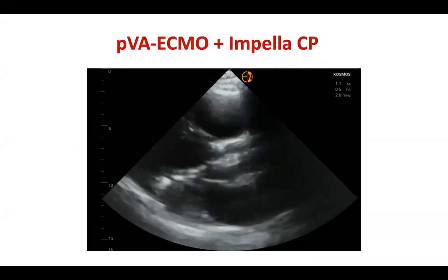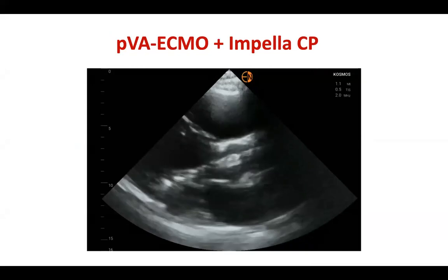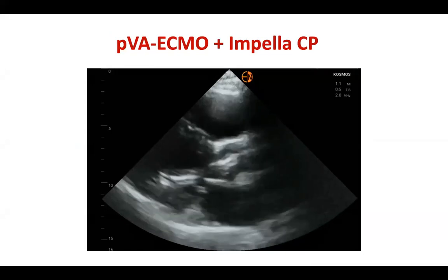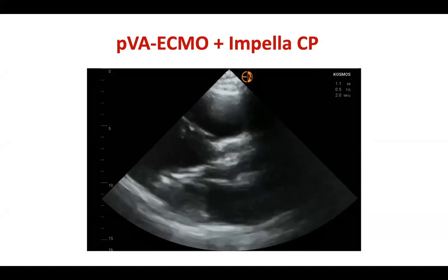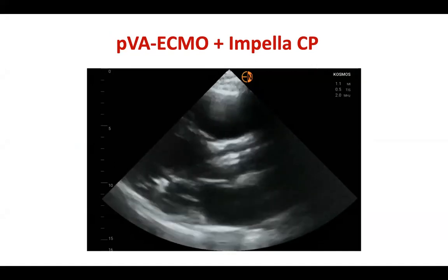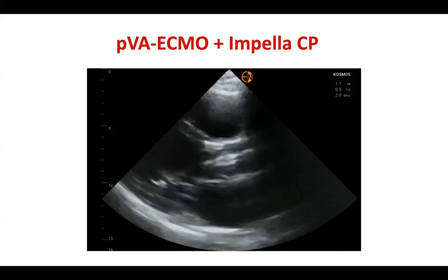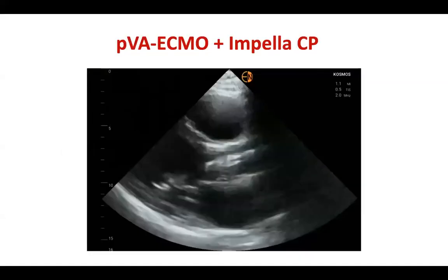And in this patient, we chose Impella as an offloading device, a transaortic microaxial device, which sucks blood constantly from the left ventricle, providing offloading of this dilated left ventricle by the effect of peripheral VA ECMO. And our provisional assessment of the patient's condition was he might probably have had sepsis-induced cardiomyopathy, because on presentation, he was febrile, he had increased inflammatory markers and high procalcitonin. And after a few days of support with ECMO and Impella, we started seeing improvement of function.